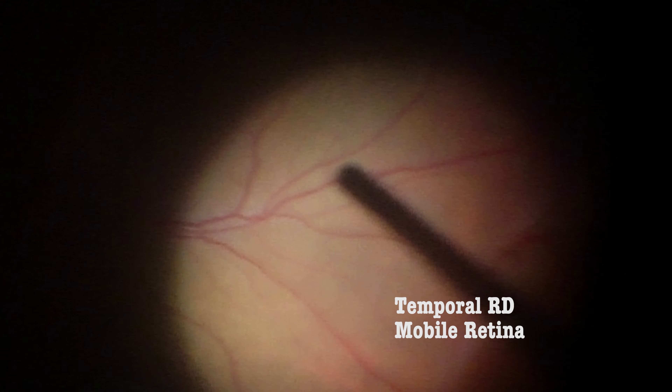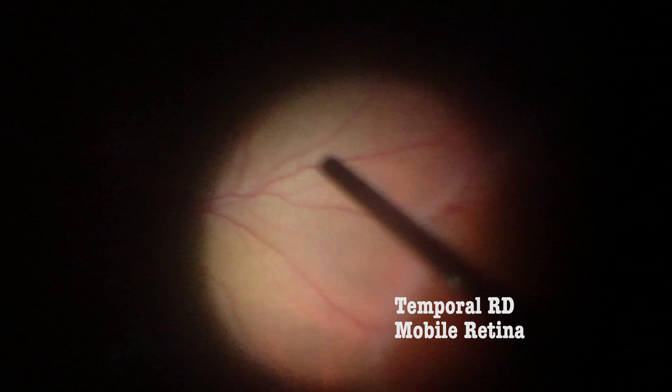The macula is pretty well attached. The temporal peripheral retinal detachment can be noticed, and the retina is quite mobile.